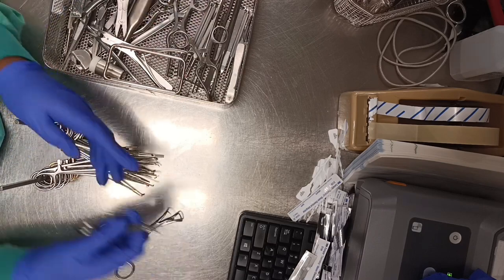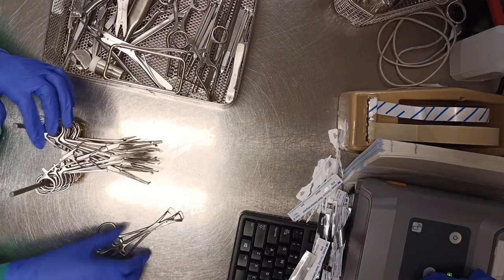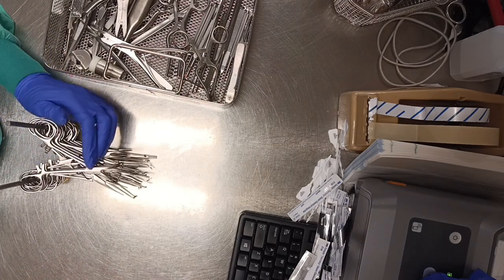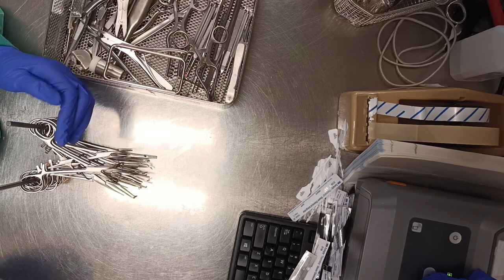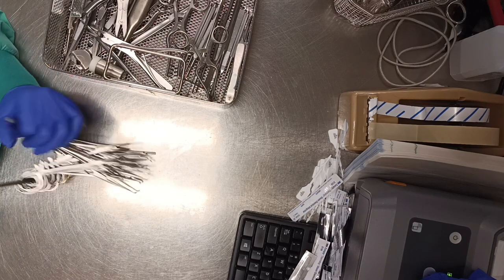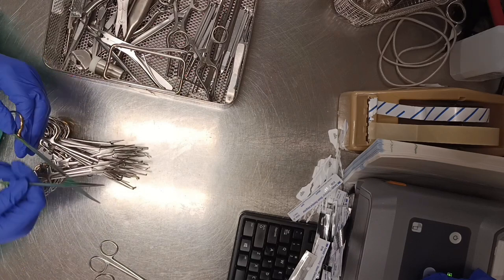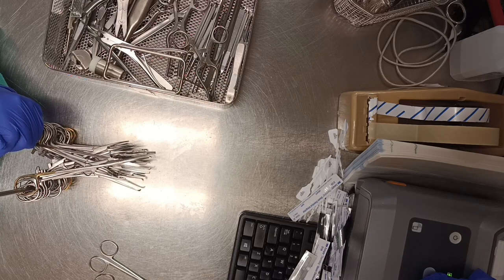So this right here are my towel clamps. I'm just going through it. That is a 3-inch, and this right here is the 5-inch. I'm just going to put them on there. And I check them off on the count sheet to indicate that I had it. And that right there is still part of the Kelly clamp. And this is the Metzenbaum scissors, the Metz 7, that is the Metz 7.